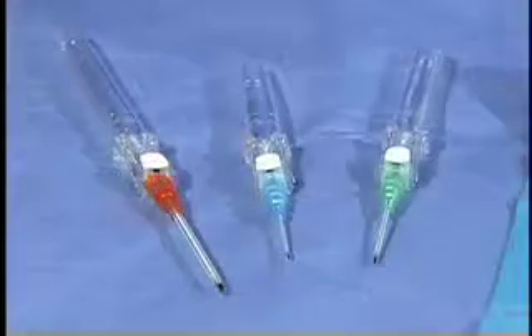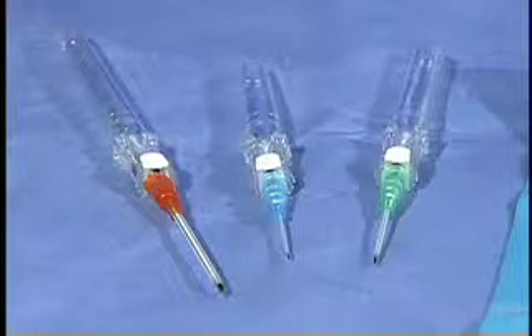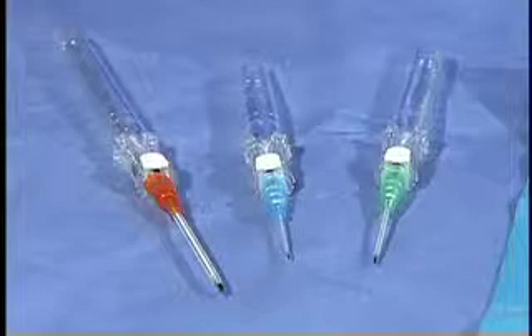IV catheters come in a variety of gauges. Selection of the proper catheter depends on the age and size of the client, the solution or medication to be infused, and the insertion site. For example, a blood infusion will need a larger bore catheter since blood is so viscous and hemolysis can occur if it is infused through a catheter that is too small.